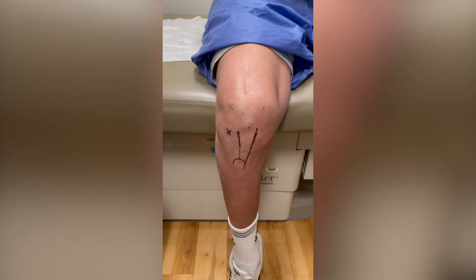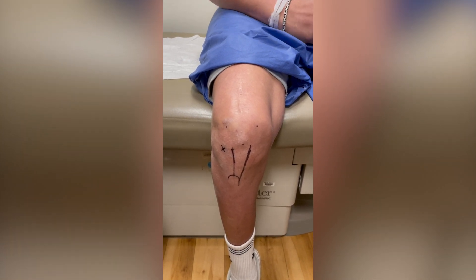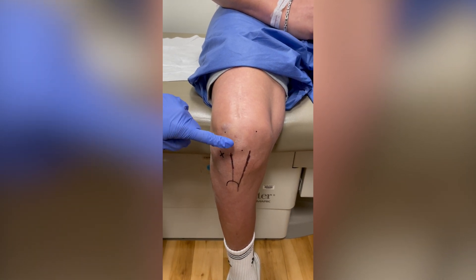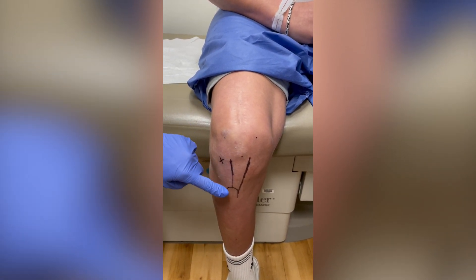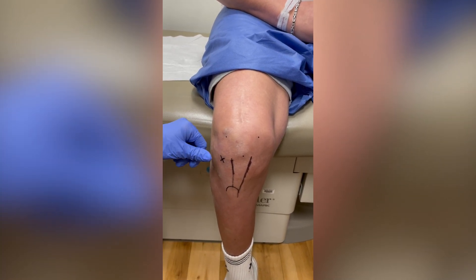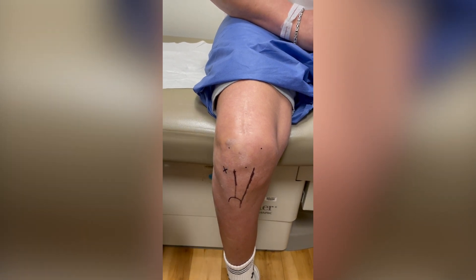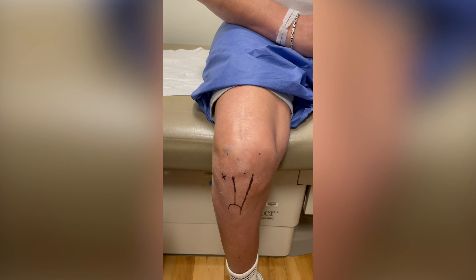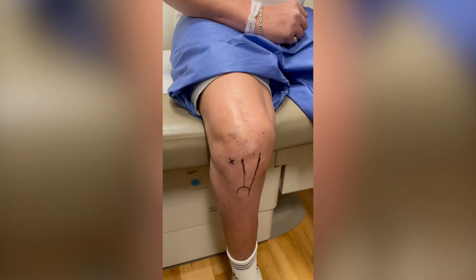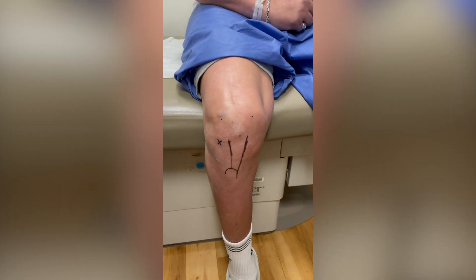Here we have a video demonstrating the standard anterolateral knee injection. First, mark out your landmarks as shown: the inferior border of the patella, patellar tendon, and tibial tubercle. Just lateral to the patellar tendon, you can feel the anterolateral soft spot at the joint line. Below that, you can feel the lateral tibial plateau, and above you can feel the lateral femoral condyle. Positioning for the injection should be at 90 degrees of flexion, with the foot hanging off the ground to allow gravity distraction of the joint space.